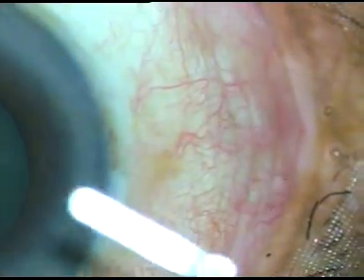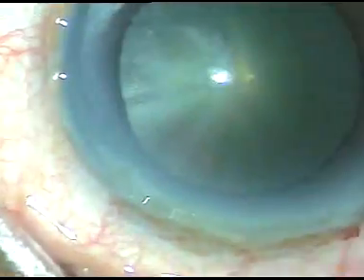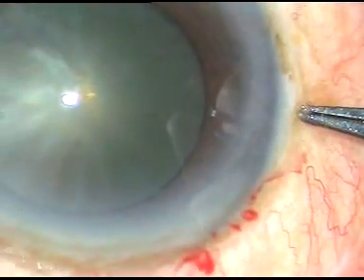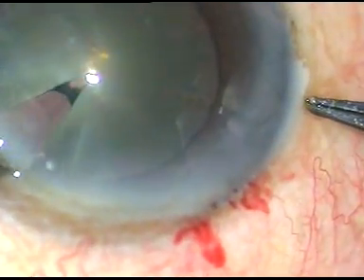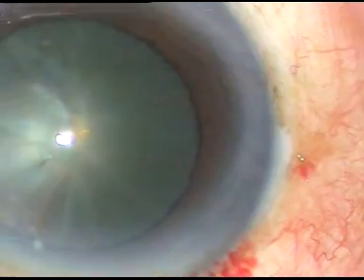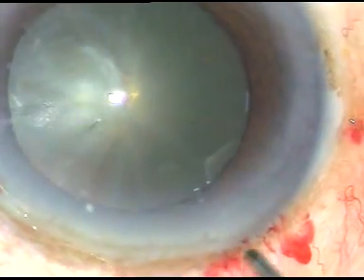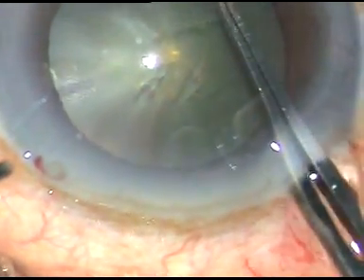Rather than using a sharp rhexis forceps, we can do this. This is the third case. The viscoelastic substance has been injected into the anterior chamber. Now fix the eyeball — the patient is under topical anesthesia. While the side port is being made, the anterior capsule is pierced. Now fix the eyeball, take the utrata forceps and just in one go, I can start rhexis from there.